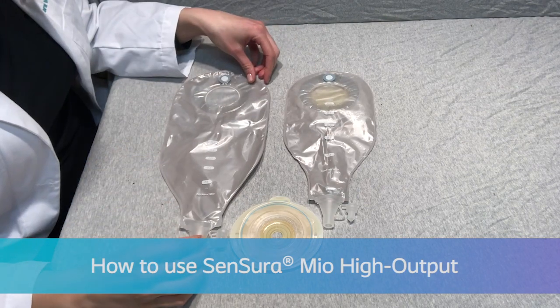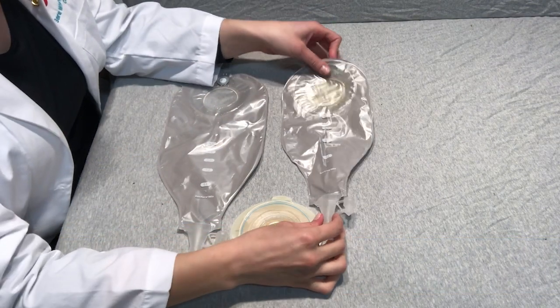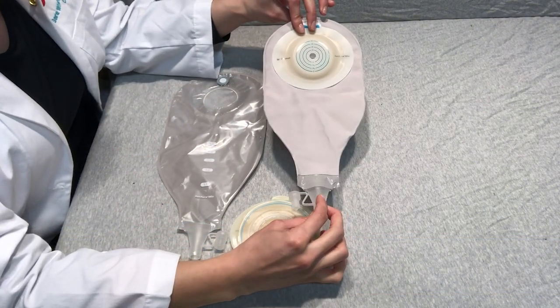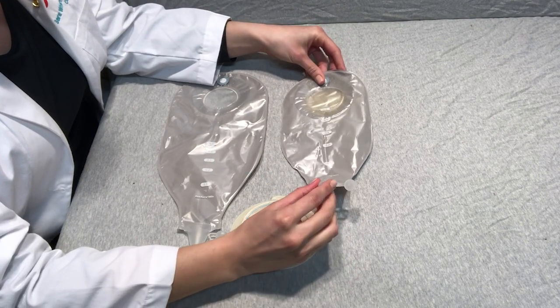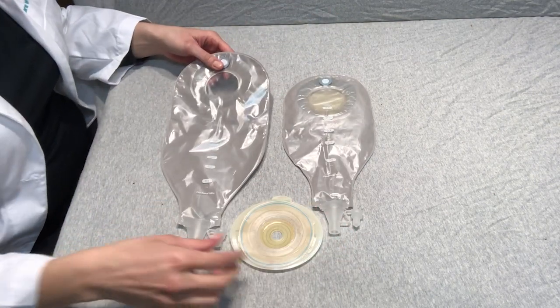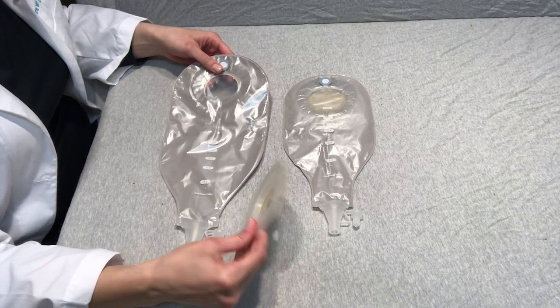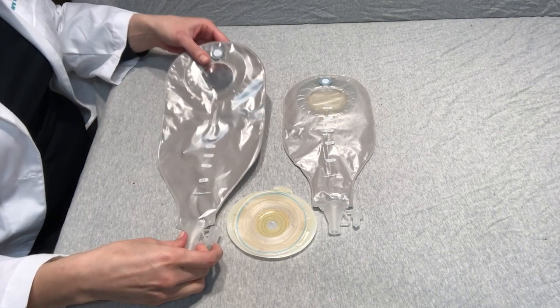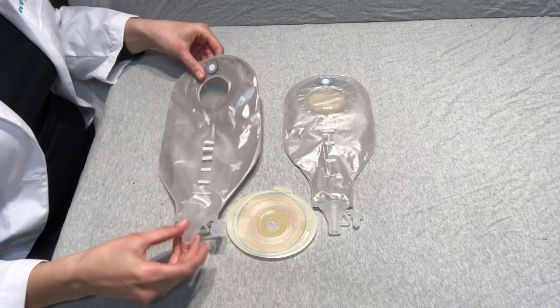I have two types of high output pouches here. The first one is our one-piece convex high output with a soft outlet. The second one I have is a two-piece flex with a convex barrier high output pouch with our tap outlet.